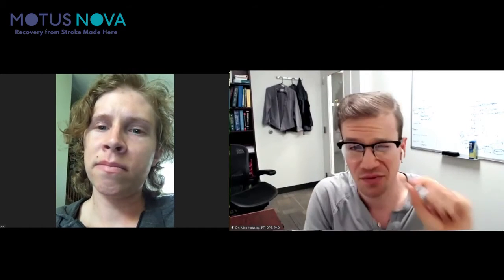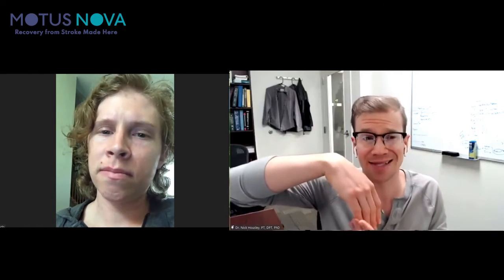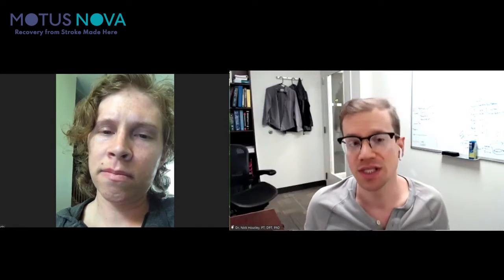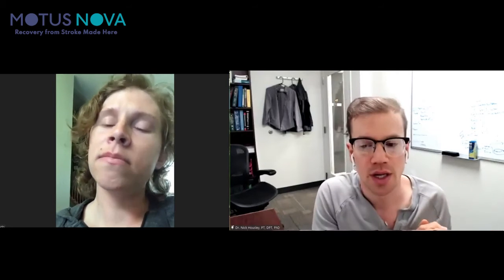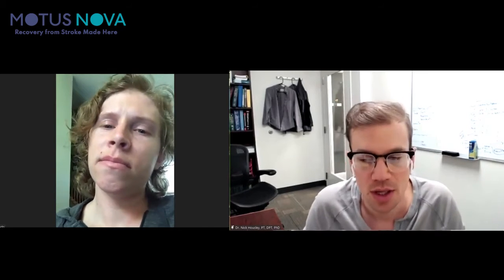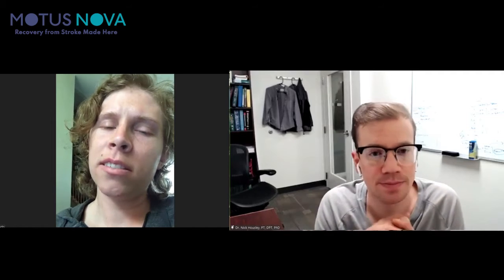So this is a little bit different than what would be done clinically, right? Like if we were putting a goniometer on someone and we had them rest and they were in a relatively flex position, and we asked them to go up into extension, we'd say, oh, they had 10 degrees of active movement, right? We wouldn't differentiate that was from 40 degrees or 50 degrees of flexion to 30 degrees of flexion. But so that's a little bit of a difference in the way that a computer has to run, in addition to the way that maybe a clinician or kind of clinical minds would think things. So your inference and your interpretation there is exactly right. It could be from tone. It could also be just from weakness, a weakness of those extensors.